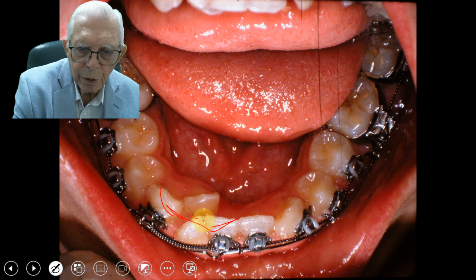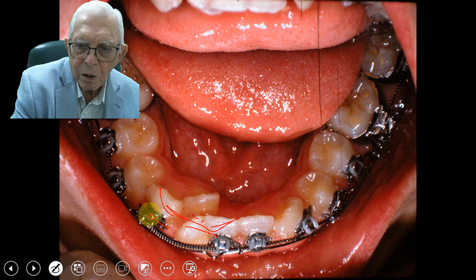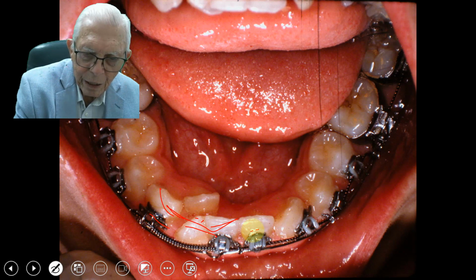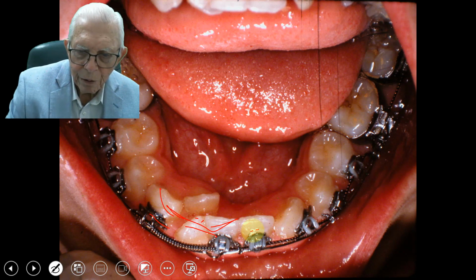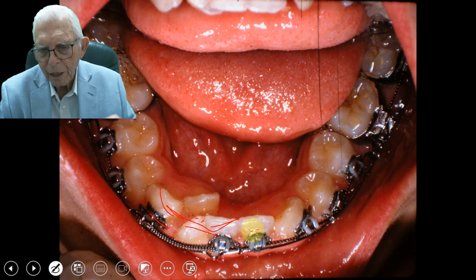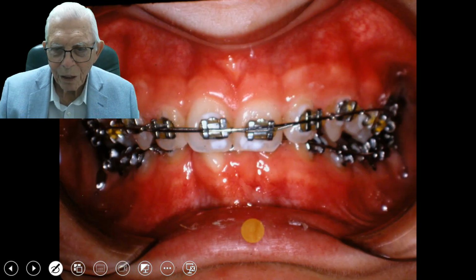While we were doing that, we opened this gap. Well, they'll change also this to bring the jaw forward. And we kind of enlarged this area here, so we had to have some room, and you bring it out like that. Now you can watch that. This makes this a lot more complicated and involved than the other cases.